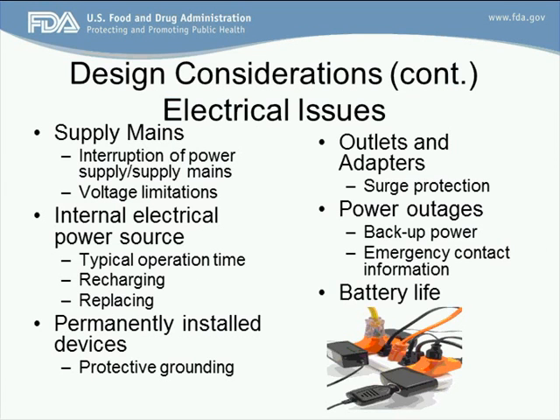Electrical issues are very big in design considerations for devices going into the home environment. Again, in the clinical environment you're looking at controlled environments, and outside of the clinical environment, it is not so controlled. You have to look at supply mains and what an interruption of power could be with the supply mains, and voltage limitations with that particular device or with the home or wherever it's going to be used.